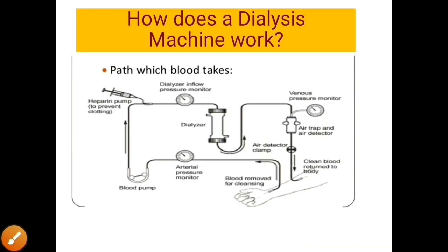Then the purified blood goes through this line and clean blood enters into the human body through the vein.